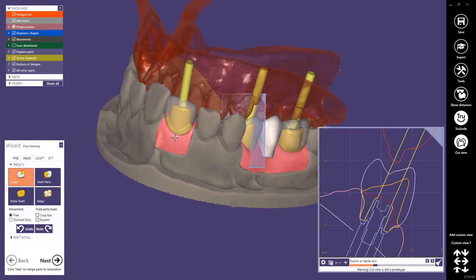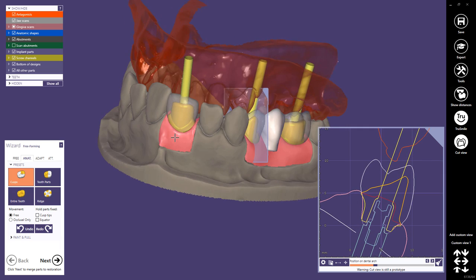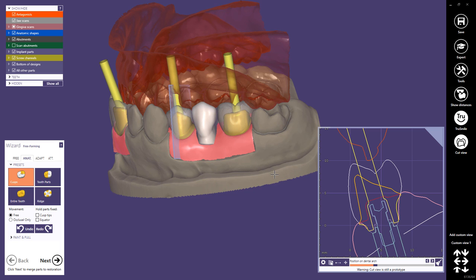As you rotate the 3D view, the cut view will move as well, so that you look at the 2D and 3D situations from a similar angle. The triangle in the corner of the 2D and 3D images marks the orientation. Observe how the cut view automatically flips when you look at the cut view rectangle from the other side in 3D.